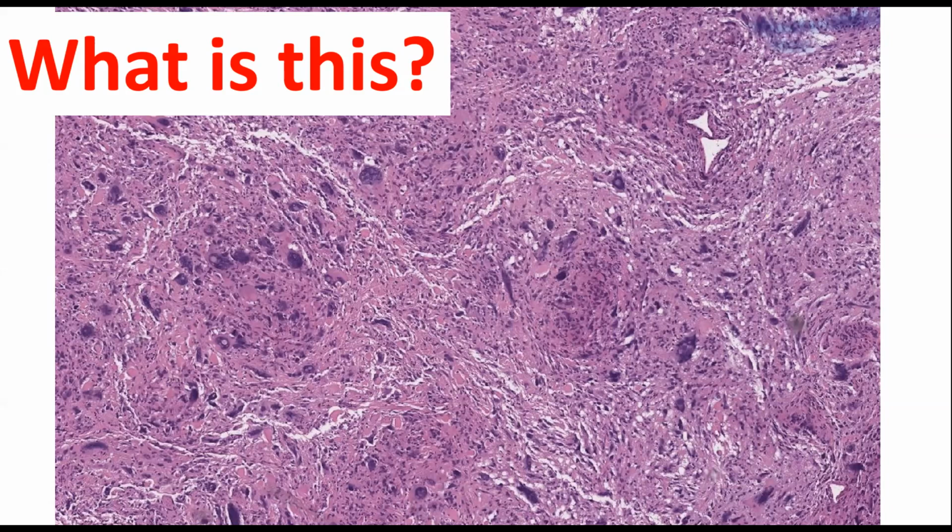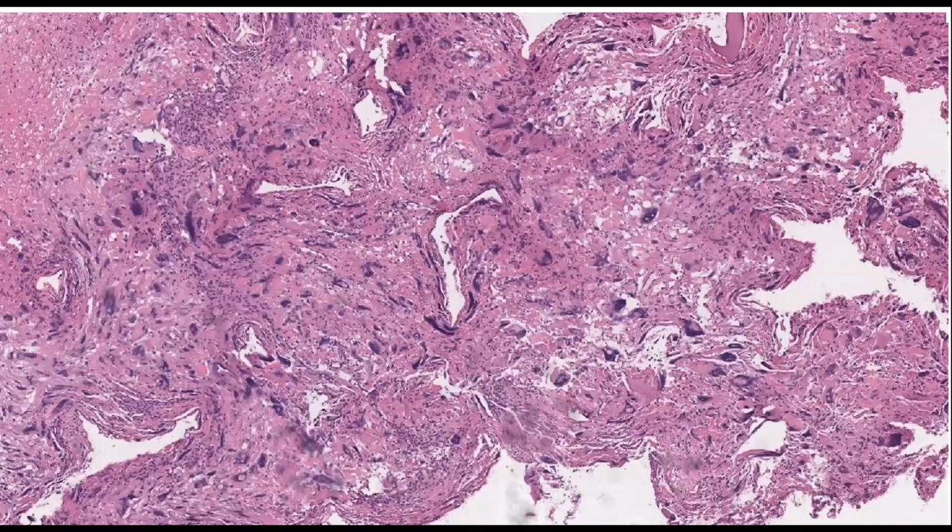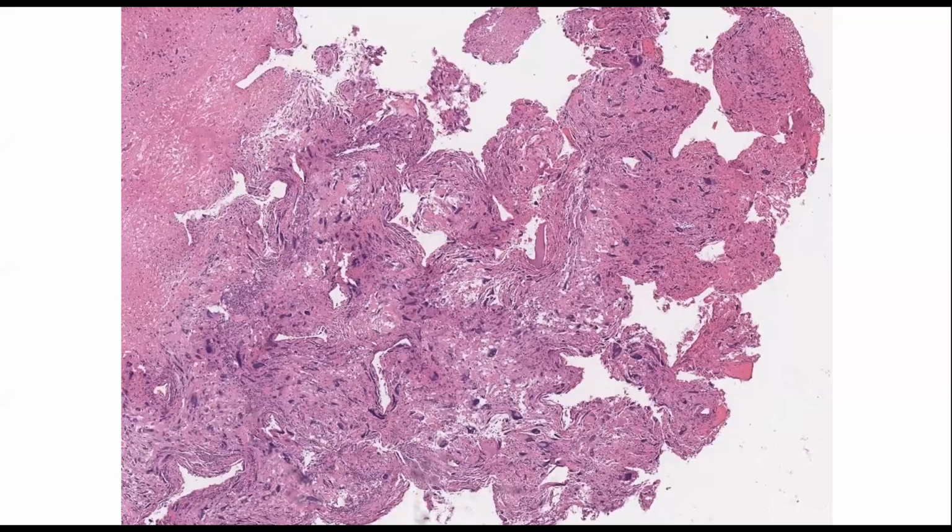It's a tiny detail. It's the clue. And there it is. This explains these nodules, if you will, or the hills and the valleys. Let's back out a little bit. Oh, it's an artifact. Yes, can you see all the angles? You can see all the angles, and it almost looks like the specimen. Let's back out some more. It's almost like the tissue is being carved up into balls or spheres in three dimensions.